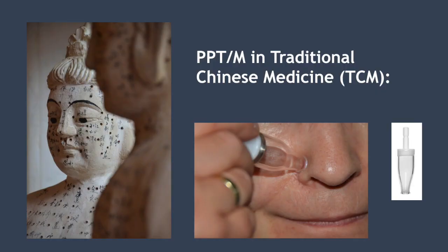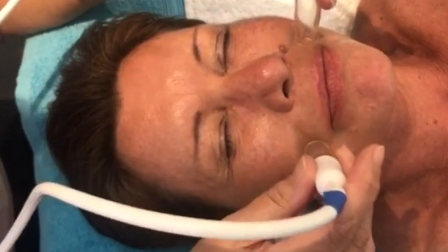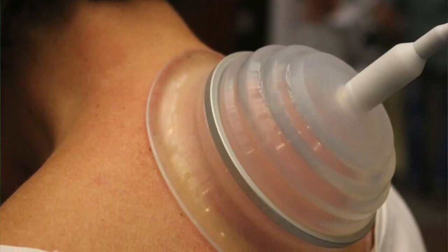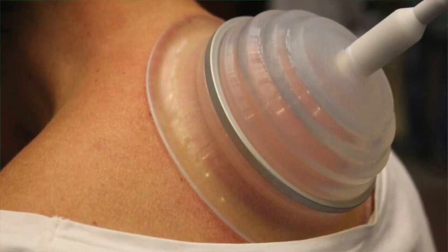If you have sinusitis, you can first Pneumatron the acupuncture points using the small genuine glass cups and then smooth out the sinuses as a part of a facial lymph drainage treatment. In the head and face area, always Pneumatron while using the double tube simultaneously and use a lower intensity for the face. In order to stimulate relief of heavy colds, you can also place the large 13 cm silicone bell and fixing ring on the so-called hormonal bump and leave it there for about 5 minutes. Of course, drinking sufficient quantities is also very important here. I'll come back to that in more detail later.